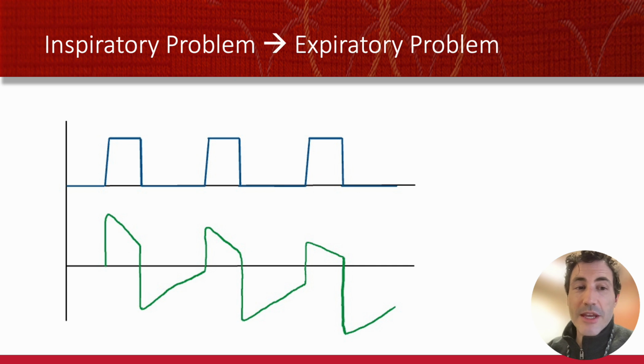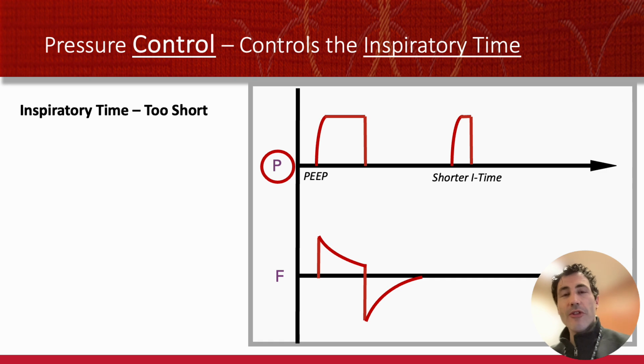And so here they maybe gained 25 milliliters of air in their lung. But now they have to breathe out 25 more milliliters of air in the same amount of time. And if they can't, now you're catching that plus maybe another 25 milliliters. And your breathing in gets smaller and smaller. And here you're going to lose preload because the blood can't come into a chest that's full of pressure. And you are not going to ventilate very well. We can see our tidal volumes getting lower and lower. Plus, it's just uncomfortable.